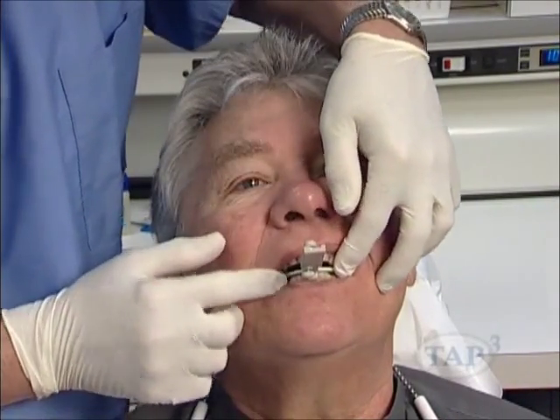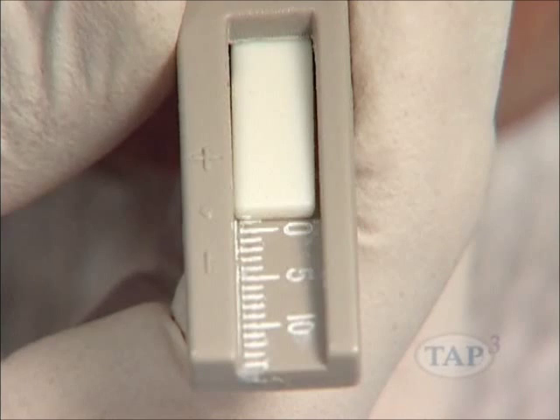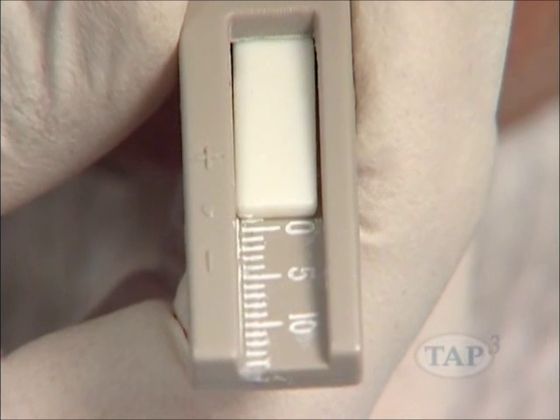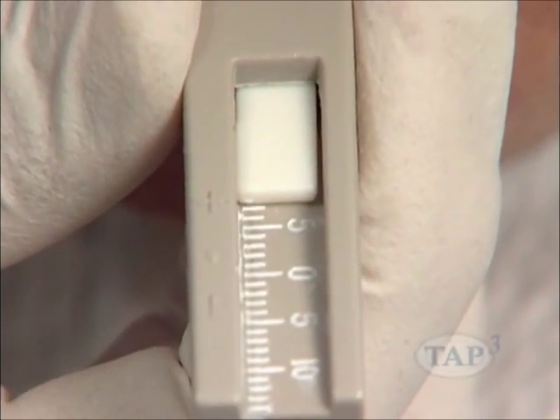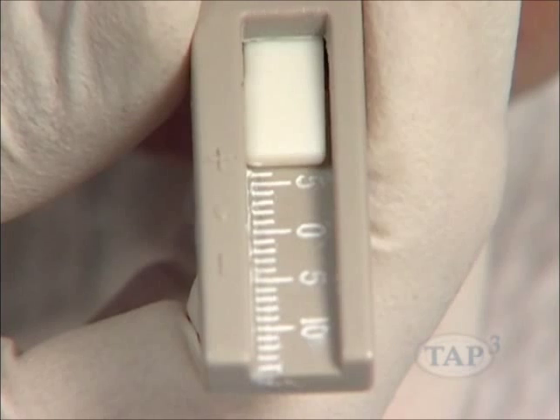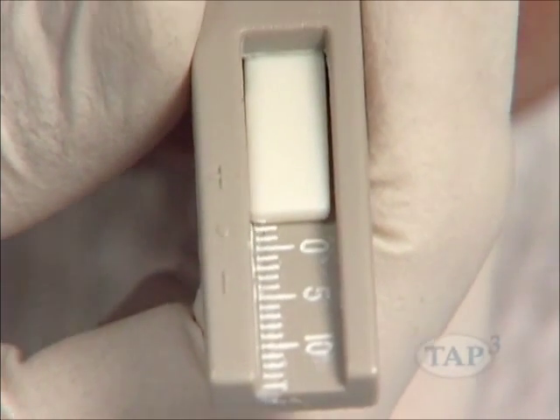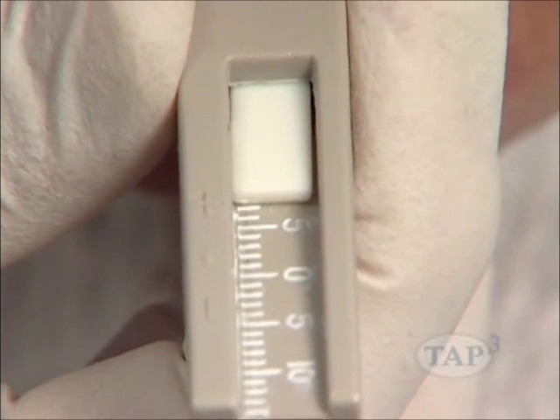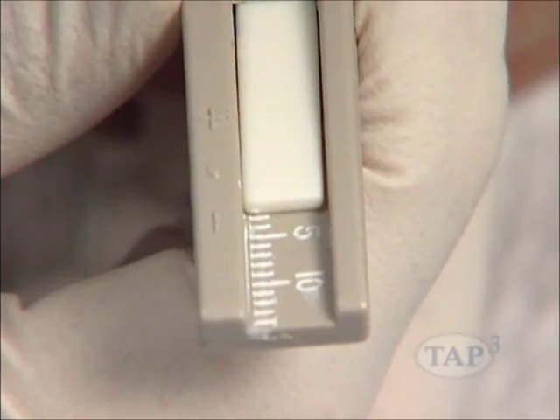Have the patient move their teeth to an end-to-end position. The gauge will read 0. This is the neutral position. Have the patient protrude their jaw forward and measure. Then, have the patient retrude their jaw and measure. In this case, the patient ranges from +7 millimeters to -3 millimeters.